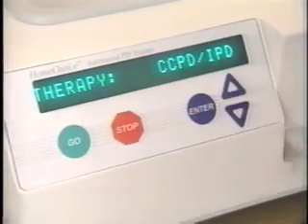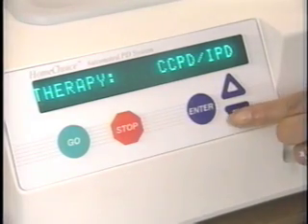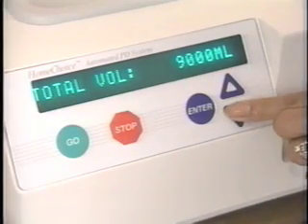To enter CCPD or IPD therapy, 4 parameters must be programmed. Press the down arrow once. The first parameter is the total volume of dialysis solution to be used for the therapy. This includes the last fill if the therapy requires one. Press the down arrow once.